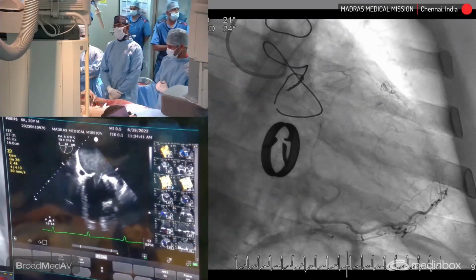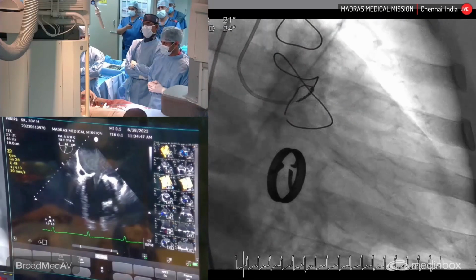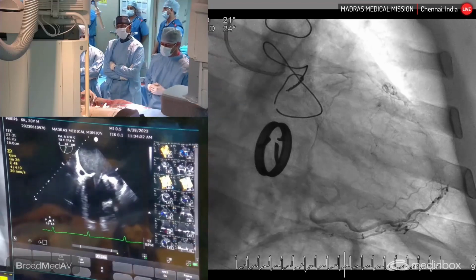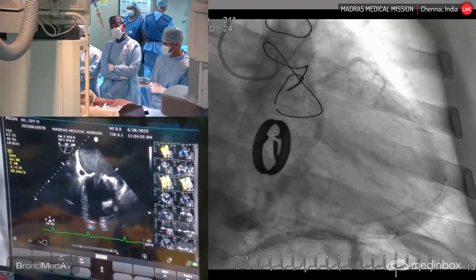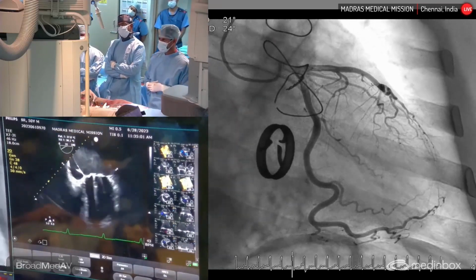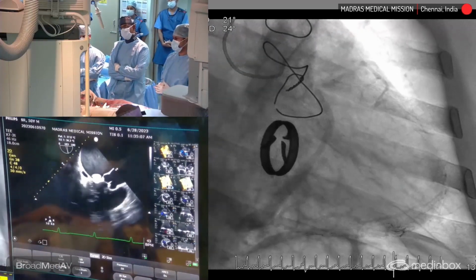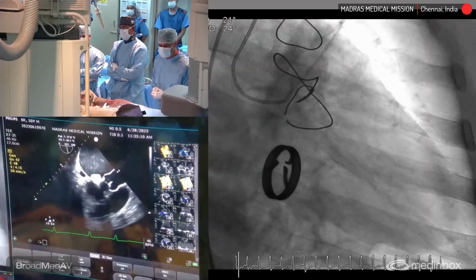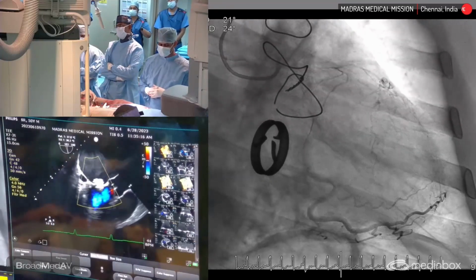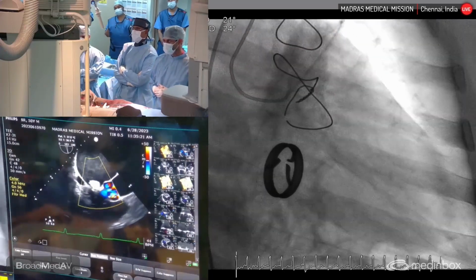So with this, we come to the conclusion of this session. This was a demonstration of a medially located paravalvular leak in a 14-year-old single leaflet mechanical prosthesis, where the radio opacity of the disc was not there, forcing use of echocardiography to assess the valve leaflet mobility. We performed the paravalvular leak closure by combining echo navigation, which means fluoroscopy guided by echo navigation. And we are able to clearly see that the paravalvular leak is completely closed off. And both the devices are seen very clearly.